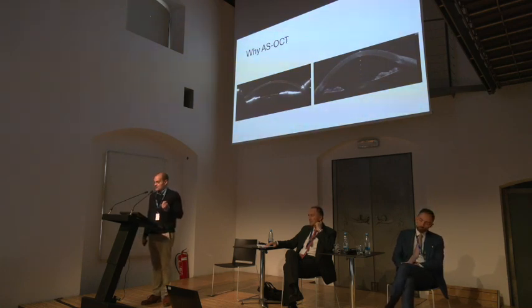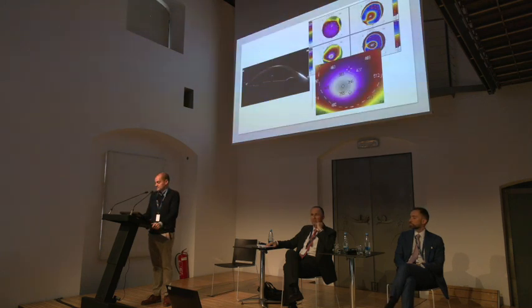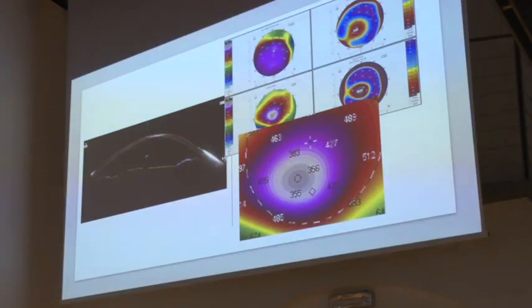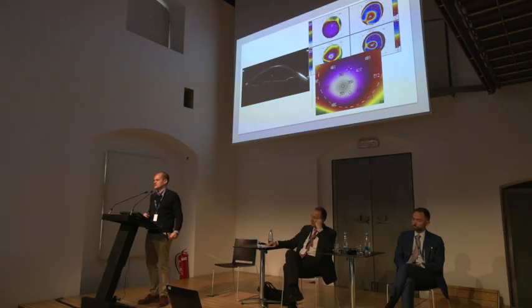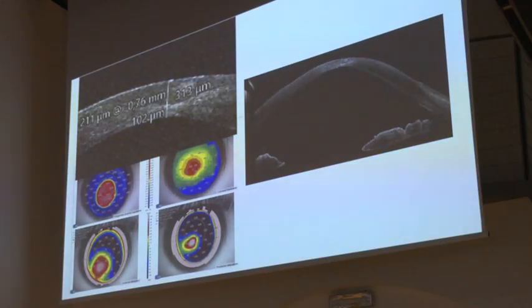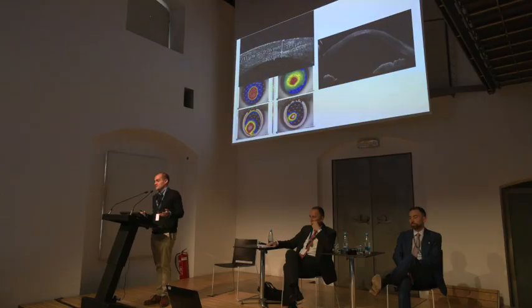Here, on this eye, you can basically go and look at the individual little parts of the cornea. But how does it look in daily practice when you're dealing with a case which is a little bit more difficult? Okay, this is a cone. Everyone knows it, everyone sees it, and you have some scarring there in the middle. But the Pentacam, the golden rule for keratoconus tracking, says this cornea is 356 microns thick, and that's a number. Yeah, that's a number, which is not true. It's 106 microns, because the Pentacam cannot differentiate stroma from epithelium.